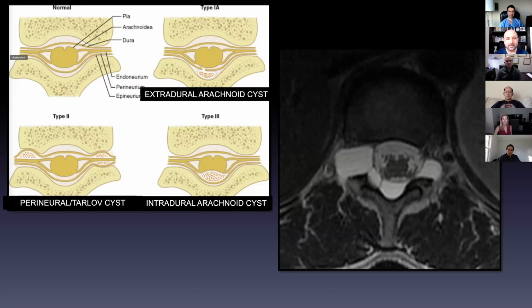Yeah, no, I think that's great, Wendy. I mean, especially that last case you showed, that's a very difficult pathology to treat. And I'm glad that you or some of your colleagues can help with these, because these are challenging. These are definitely the cysts, especially the sacral cysts.